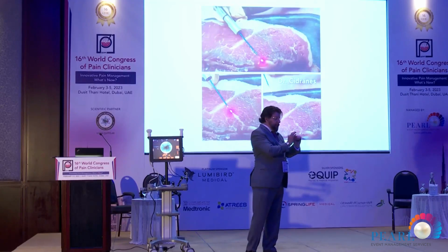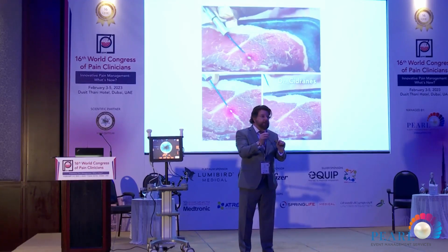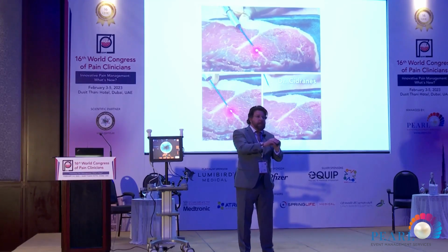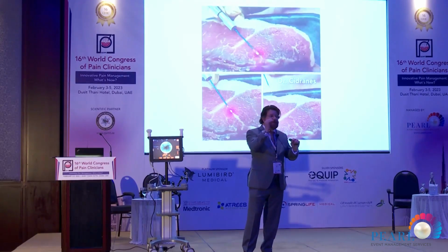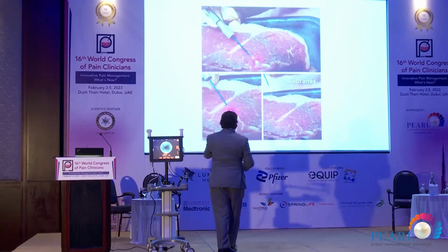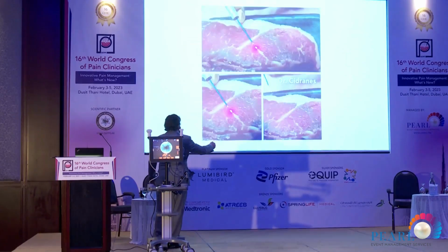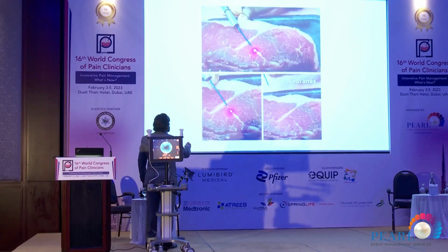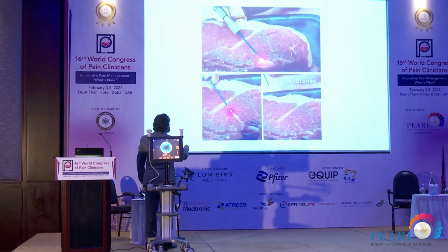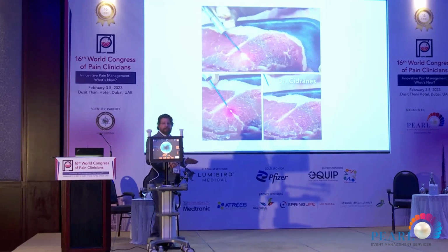your patient. Imagine that you have one tumor and you want to make ablative radio frequency, you put it exactly inside the metastasis, and it's possible for you to first use the laser, and after that you prepare the patient for the ablative radio frequency in the same site. It's a good opportunity. Look, this is the ablative. Look at the scar. And you have the contour immediately. This is possible to do through the microendoscopy.